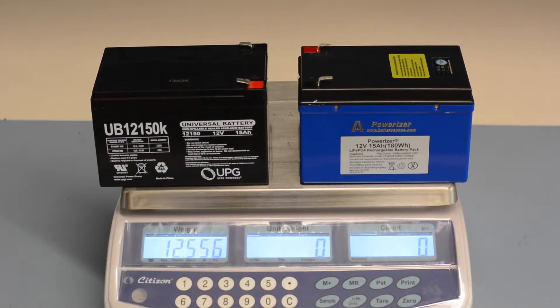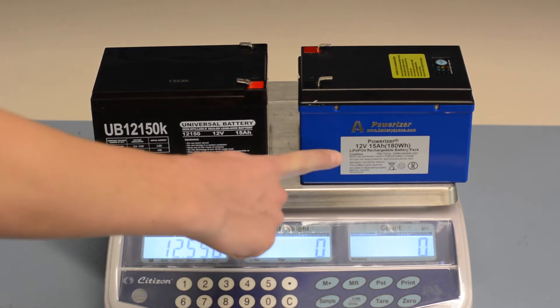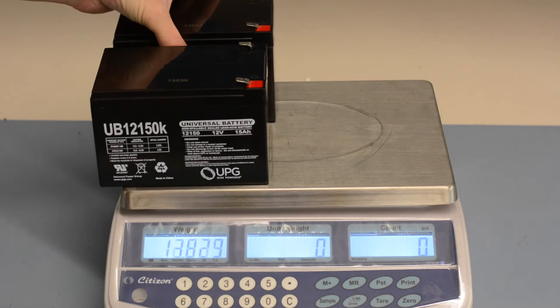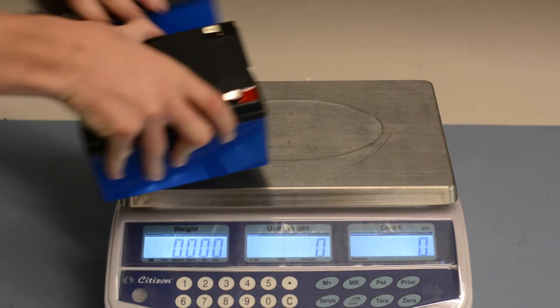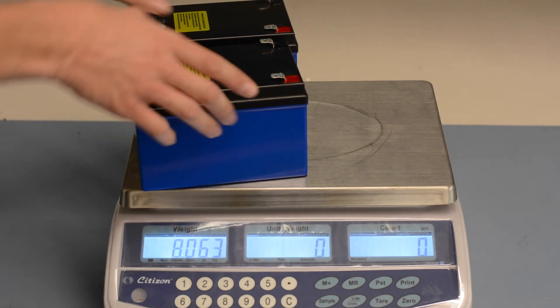Currently, the ZX-1 offers two types of batteries. There is the lead-acid option, which offers a range of roughly 5 miles, and then there's the lithium option, which offers a range of roughly 10 miles. Both lead-acid batteries weigh about 17 pounds, while the lithium batteries weigh about 8 pounds, which means there's about a 9 pound difference, also meaning that the lithiums weigh about half as much as the lead.